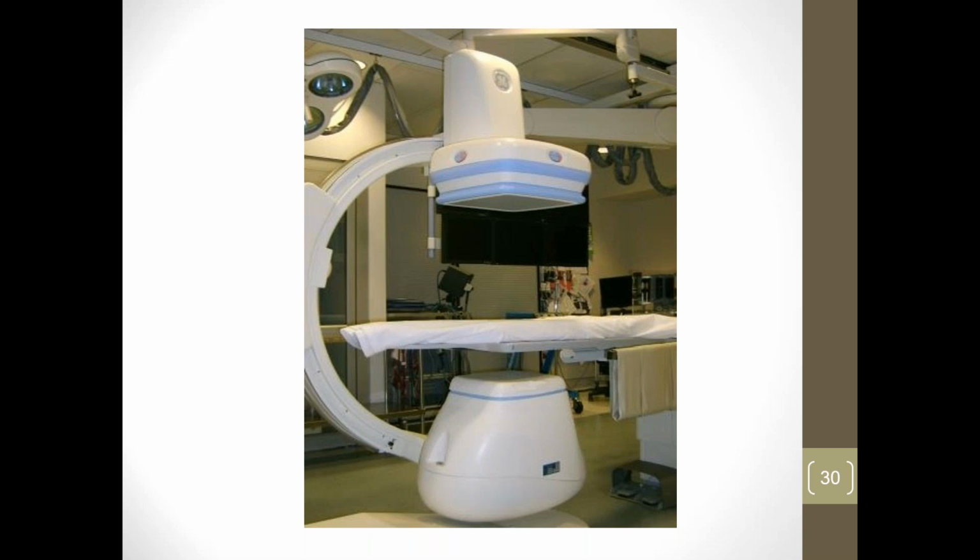That electronic signal then goes from the C-arm, and maybe you can see in the back, you can see some cabinets. There'll be an image processor in one of those cabinets. The image processor will take those images, put them together, and then display them on the big screen, which is, again, hard to see in the back. It does it instantaneously. There's absolutely no way that you can see that it's not.